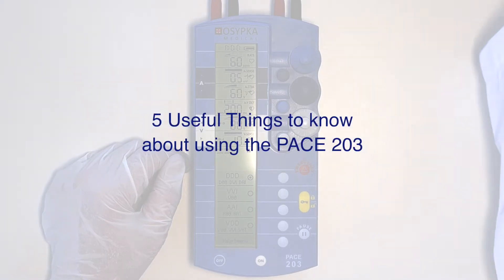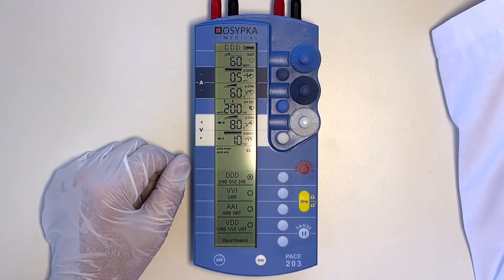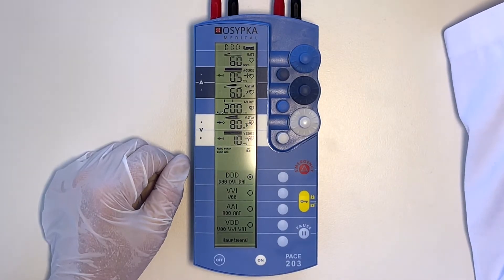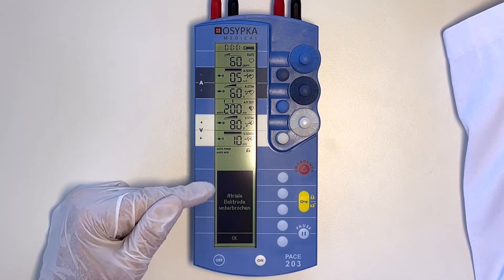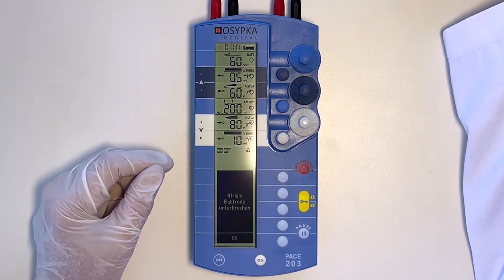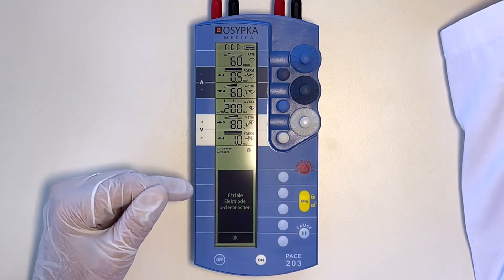These are the five things you really need to know as a bare minimum for this device. The first is, if the device makes a noise, there will be a message. Don't ignore it — read the message. The message will appear in the lower section of the display. The two most common messages are: change the battery, or lead is disconnected.